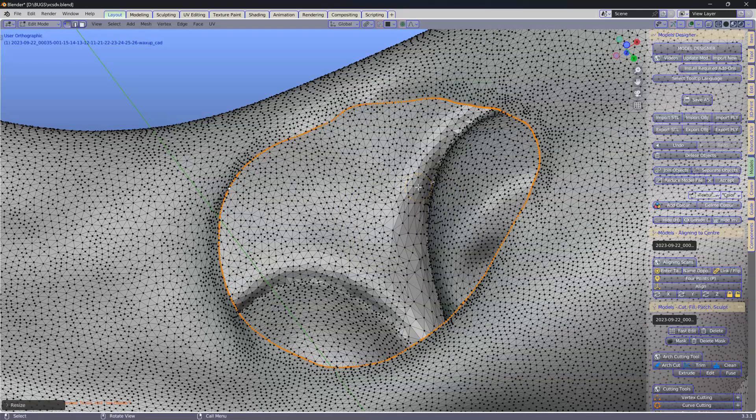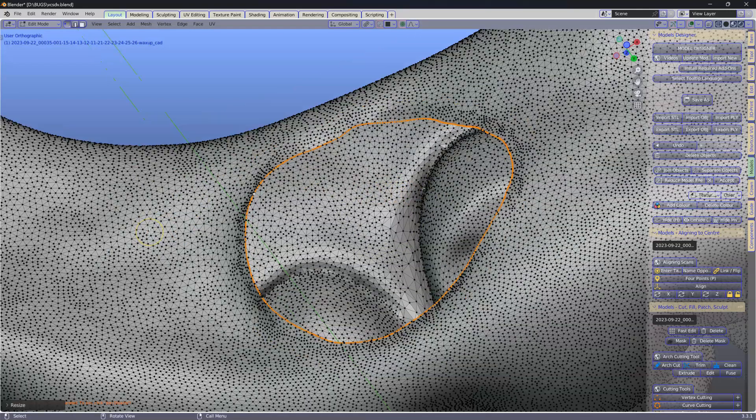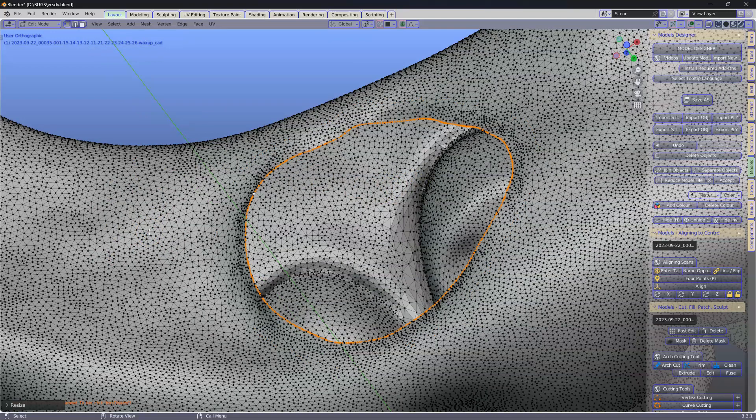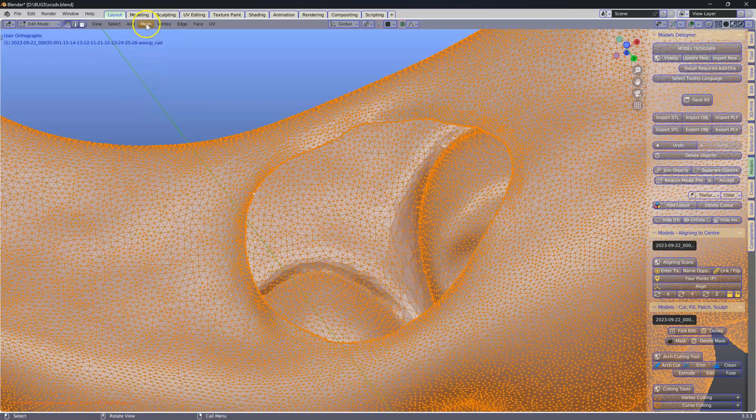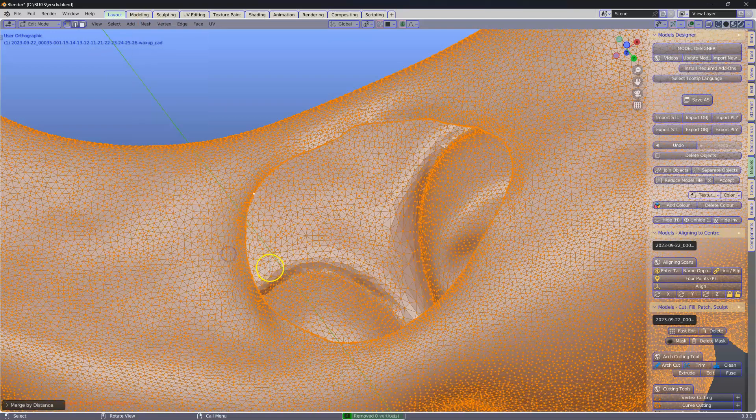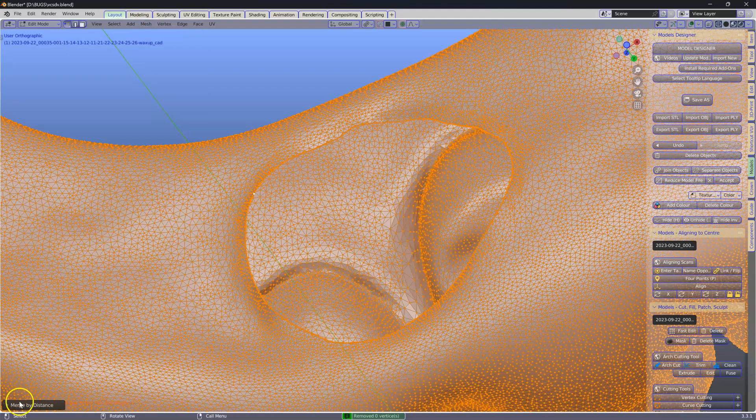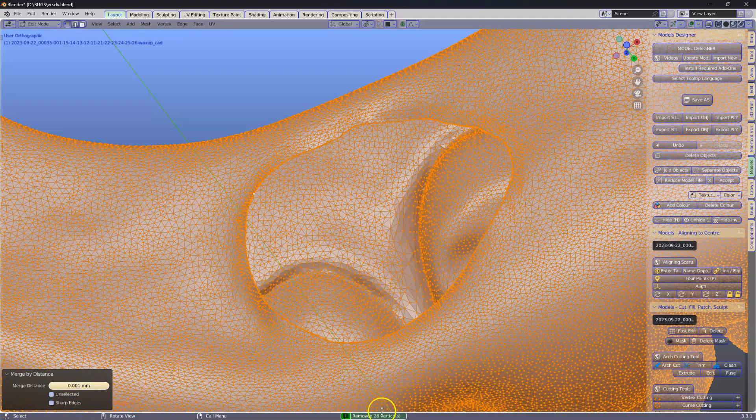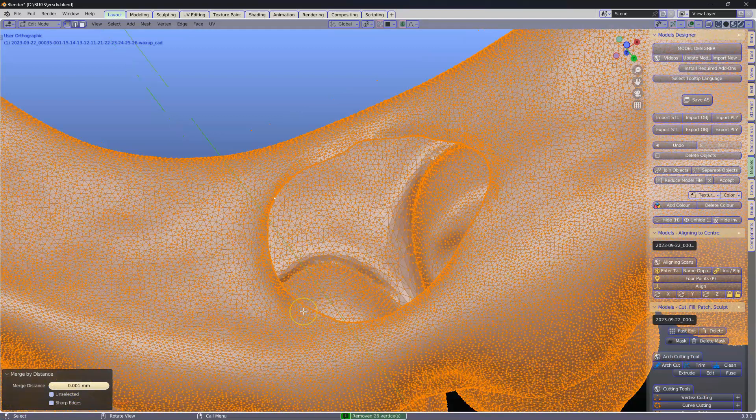Then I'll check the meshes. So A, Mesh Cleanup, Merge by Distance, and that all looks good. I'll put that to 0.001 and we've got 26 removed. That's good.